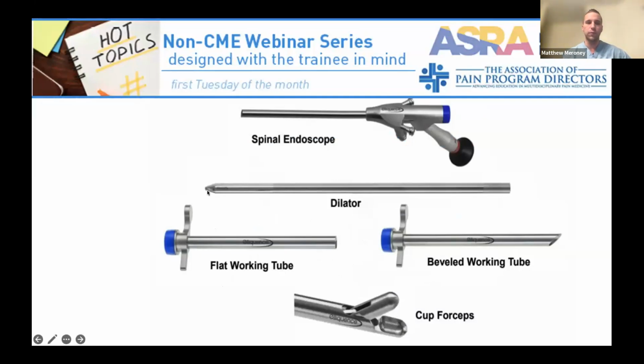So obviously this is pointed, but it's not sharp. So there's a lot of tactile feel if you hit fascia. You can feel like you need to put a lot of force into it, and you can penetrate through a lot of things. But I like to put a little nick with a blade so that I don't feel like I have to plunge into it.